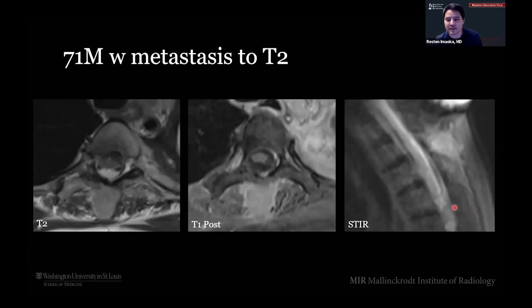We'll just do a very quick example of what cryoablation might look like in the spine. I didn't mention it before, but we don't often use cryoablation in the spine because of the way that it works. Like I did mention that with radiofrequency ablation, having an intact cortex is protective. When you have ice or microwave, that is not true at all, right? So if you were to make an ice ball in the vertebral body, it doesn't matter if you're close to the cortex, that ice is going to form to whatever size that particular probe makes. And that means that if you're close to here, you're really not going to see it until it's too late, and then you're freezing through the cortex into the cord or into the nerves.